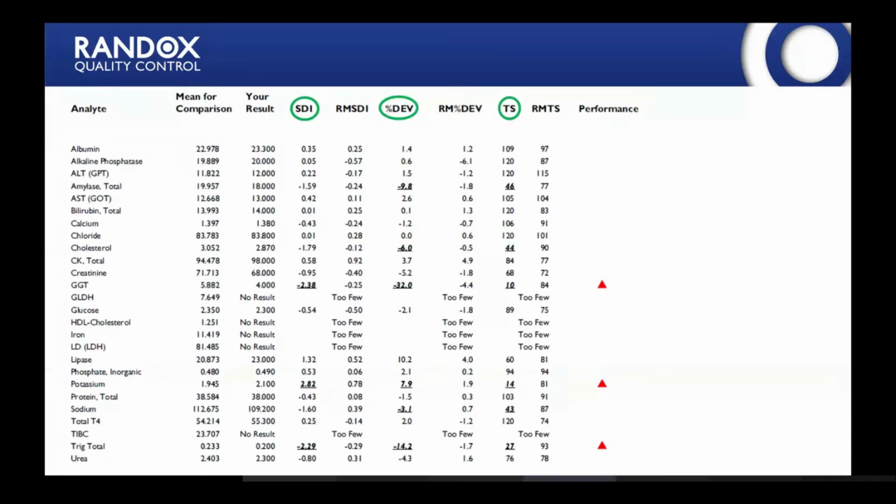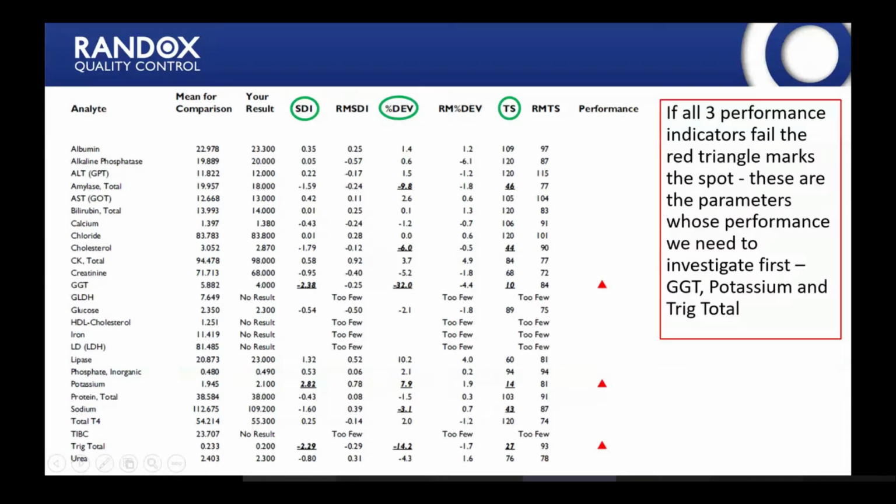So we've got our three performance indicators, and as we said, anything where you fail on it is bold and underlined, and we want to find our red triangles. So if all three performance indicators fail, we have our red triangle, and those are the ones we want to investigate. In this instance, we want to look at GGT, potassium, and Triglycerides total. These are going to be the three parameters that we need to investigate for this particular sample.